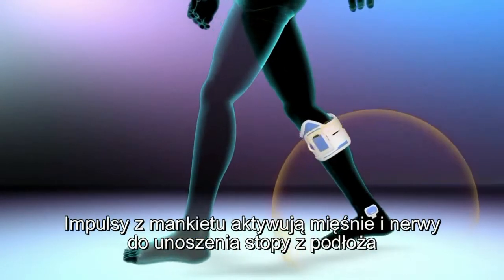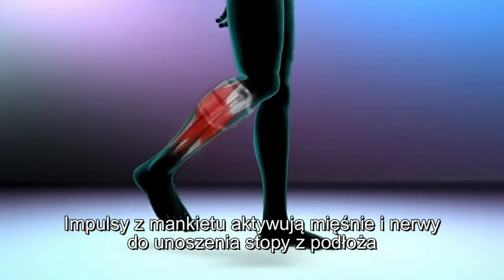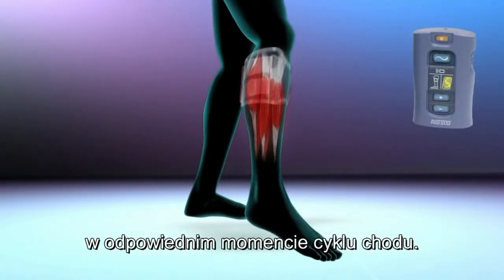The pulses from the leg cuff activate the nerves, stimulating the muscles that cause the foot to lift off the ground at the appropriate time during gait.